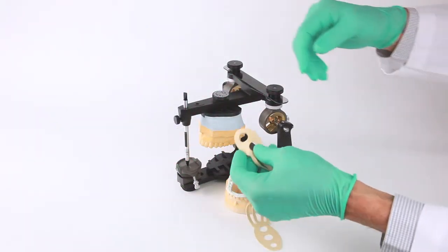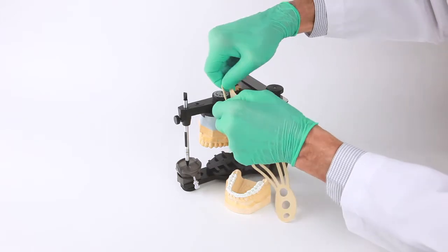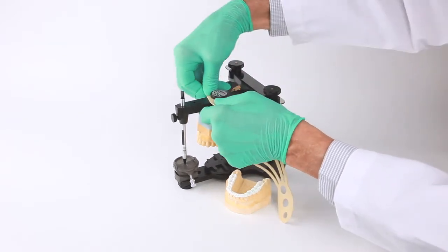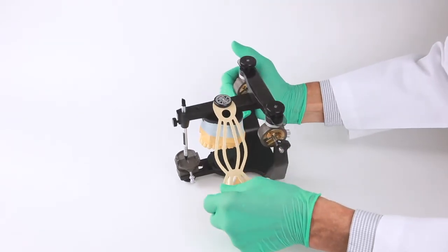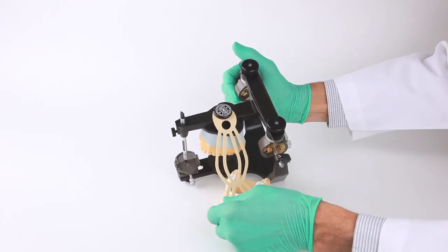Once the maxillary cast has been mounted with the mounting jig or facebow registration, the flexi-mount is attached by placing one of the two large holes on the end of the flexi-mount over the thumb screw on the articulator arm.